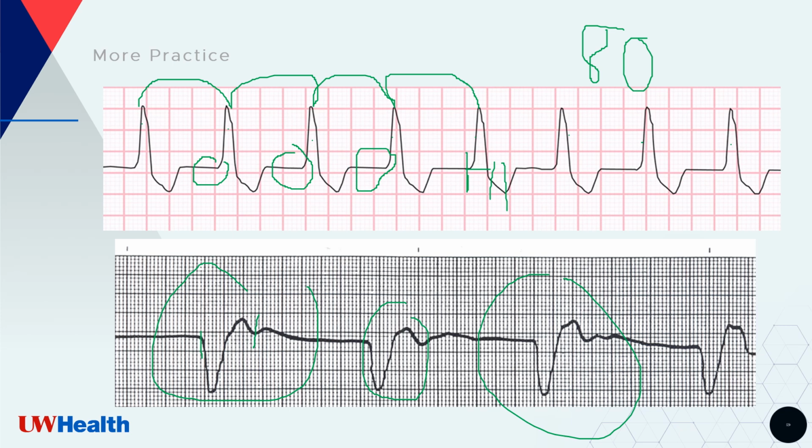Idioventricular rhythm is considered a lethal rhythm on our final exam and in most textbooks. So you'll need to not miss this one. Learn those components well: a wide complex, regular rhythm, rate between 20 and 40. Those are your ventricular rhythms.